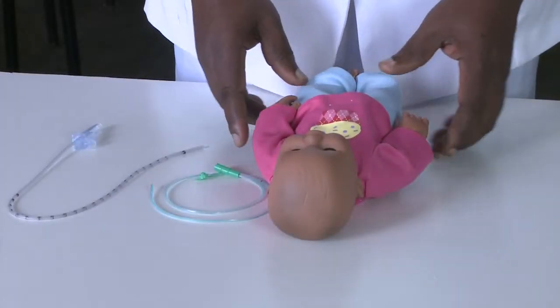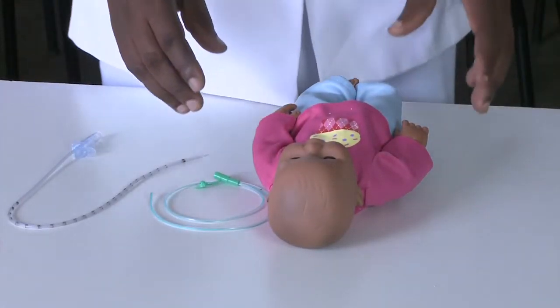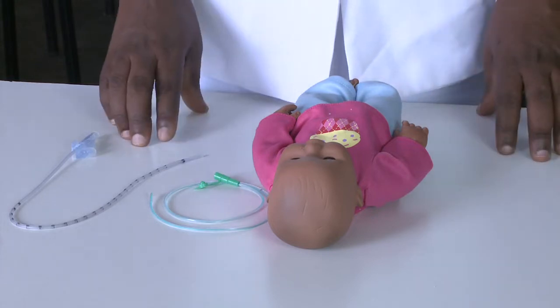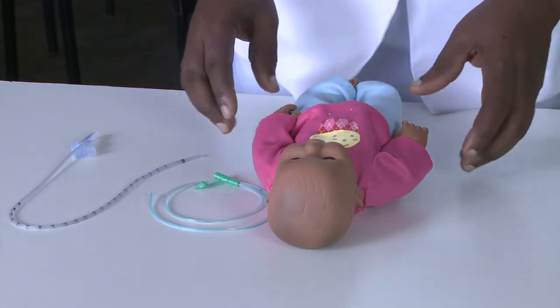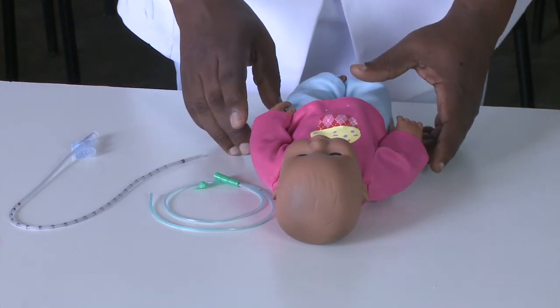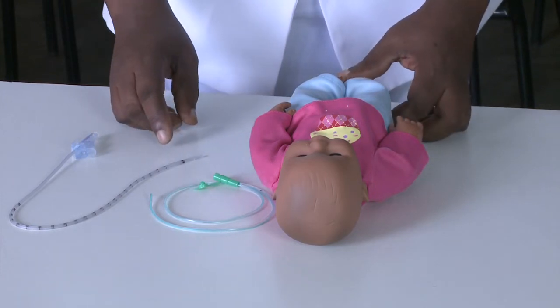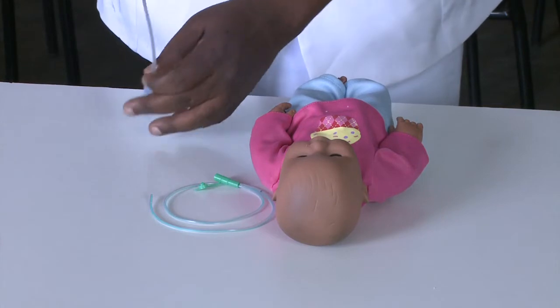I have my patient here. This is a premature baby in the neonatal ward who is having respiratory distress. I'm going to put an OGT for feeding because the baby can't take orally. Before inserting the OGT, the baby has some secretions in the nostril and mouth, so I'll suction first and then insert the OGT.